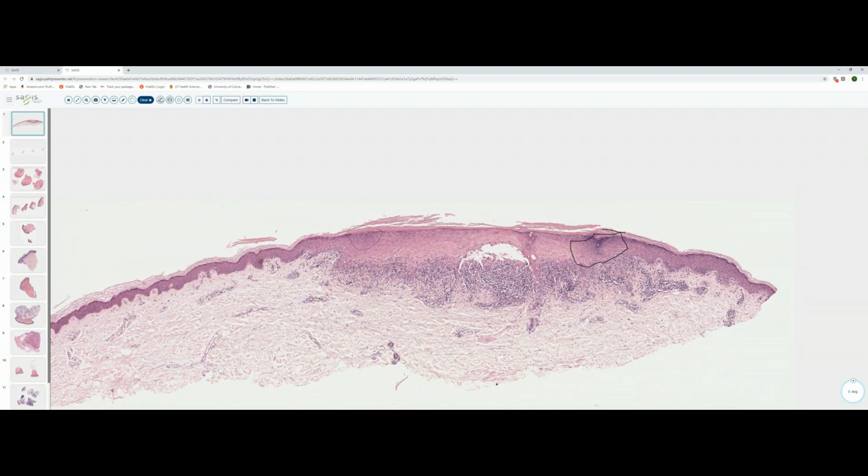All that being said, I've seen plenty of BLKs that look just like lichen planus, and I've been ready to sign out the case as lichen planus, and then you look at the history, and it comes in as papilloma, just rule out basal cell. And rule out basal cell is a real common clinical history to guide you to the diagnosis of a BLK.